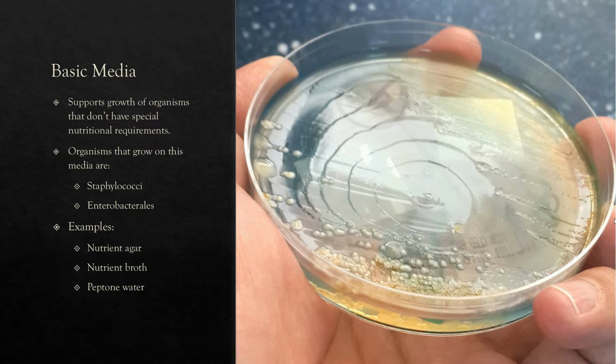The examples of basic media are nutrient broth, peptone water, and nutrient agar. Nutrient agar is a basic medium for growing non-fastidious microorganisms, and nutrient broth is actually a liquid medium.